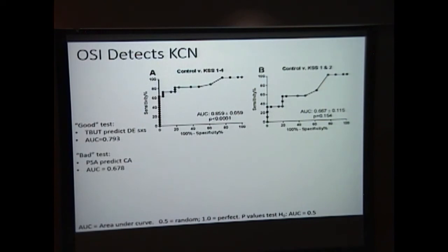How does OSI correlate versus wavefront aberrometry or contrast? So wavefront aberrometry, if I'm not mistaken, is a ray tracing type tool where you shine a ray and then you see where that ray goes. So that is a form of forward light scattering analysis. What it doesn't pick up is the continuous aberrations in the optical system. So if there are anterior vitreous or anterior chamber opacities or lens opacities for that matter.